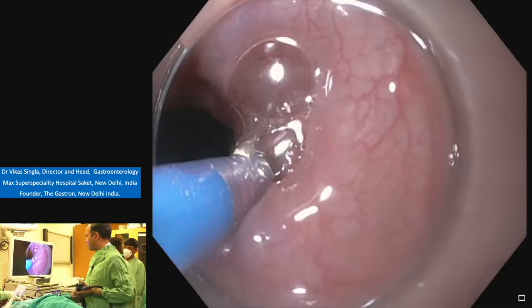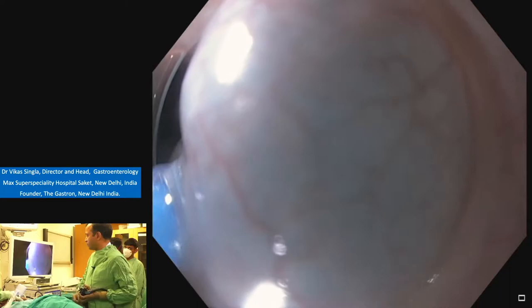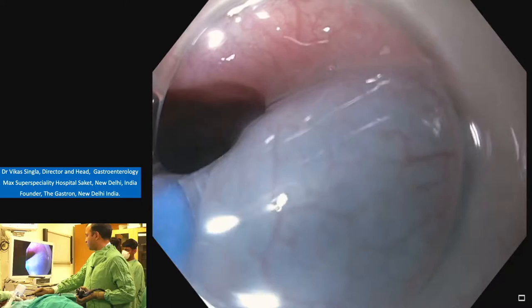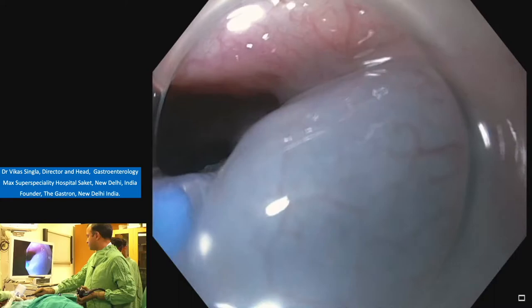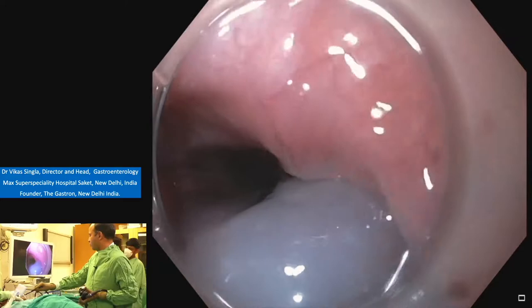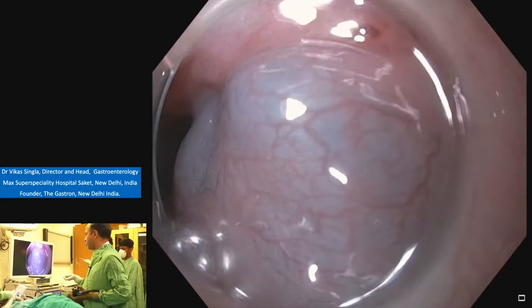Inject while pulling, and the moment we get a bleb, we stop there and use the up knob on the up-down wheel. We'll inject around 20 ml of saline stained with indigo carmine. So we're injecting around 20 ml of saline. Now we can see it's a good bleb, occupying at least 50% of the esophageal lumen.